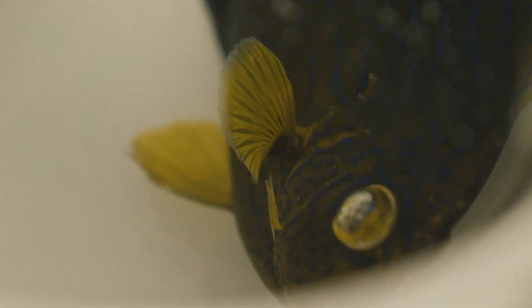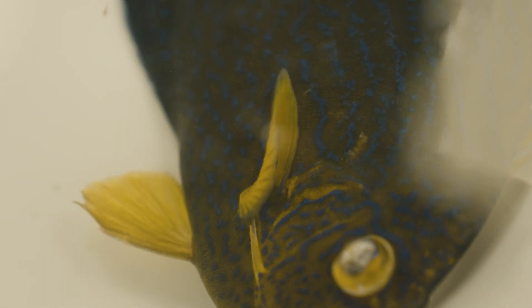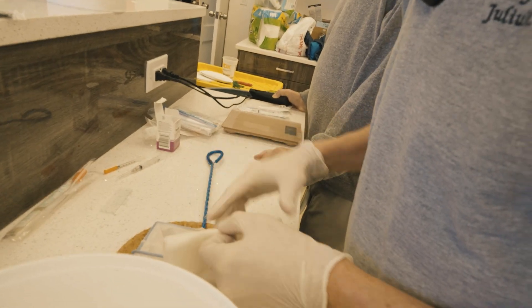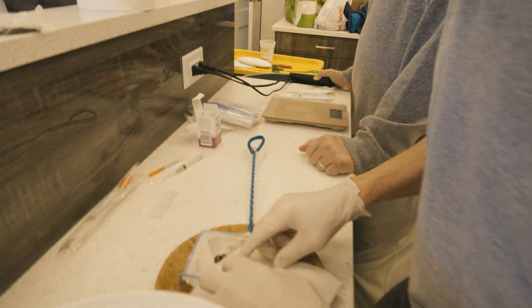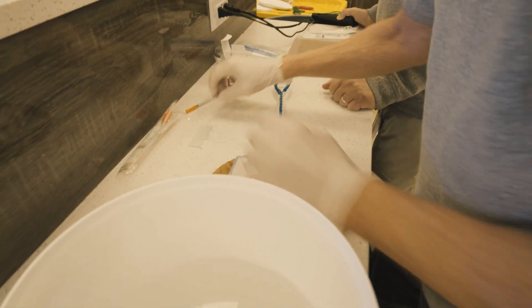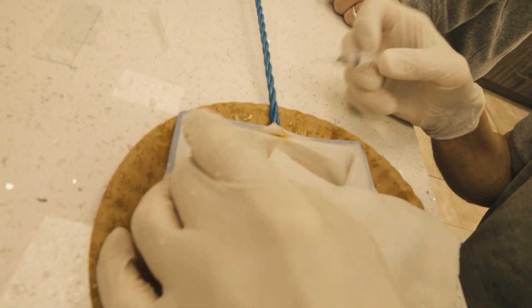In the meantime, he's taking samples of the eye, he's degassing the eye, and he's giving them shots of Baytril. Because of the fact that we're concerned about what might be going on inside the eye, we're going to be sampling.